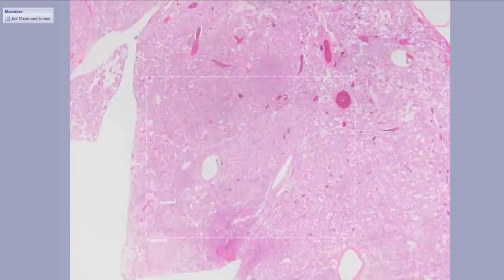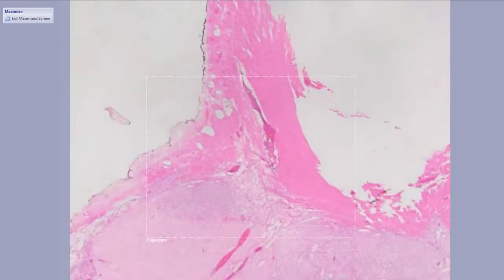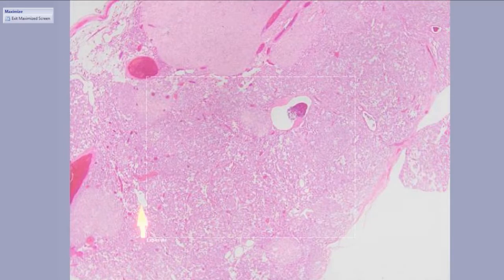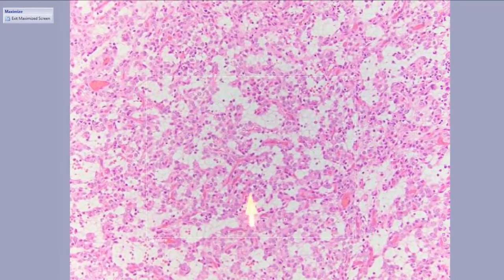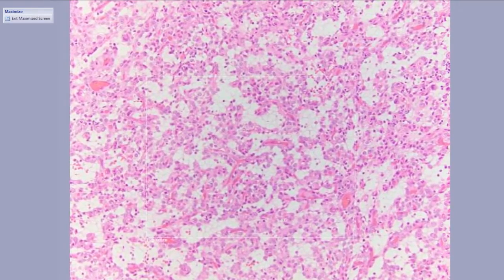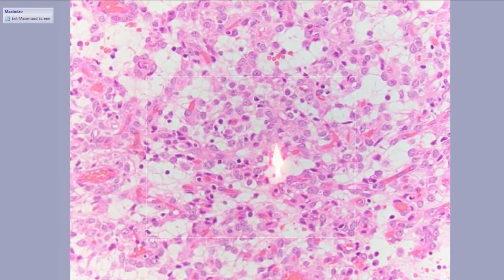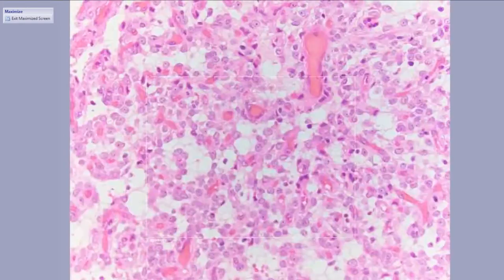Here's a stomach mass, and this seems more deep than some of the other masses. There's no mucosa here. We're down and kind of in or beneath the muscularis propria. And at low power, this looks sort of vasculature. You can see there's these spaces that it's forming. Going on higher power, still looks vascular. There's a lot of vasculature in it as well, plenty of blood well contained within these vascular channels, and the cells are actually very epithelioid, rounded, very benign. There's no mitotic activity, there's no necrosis.